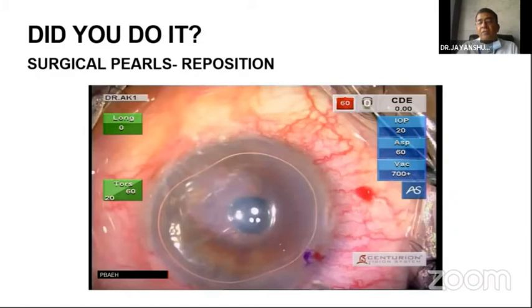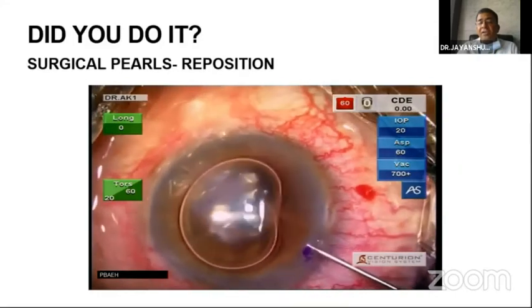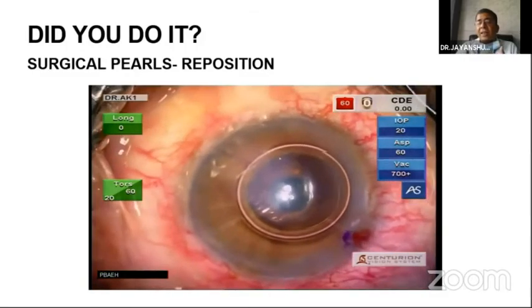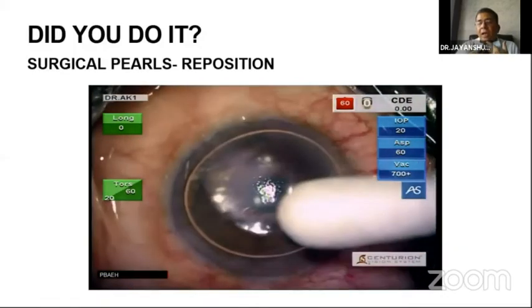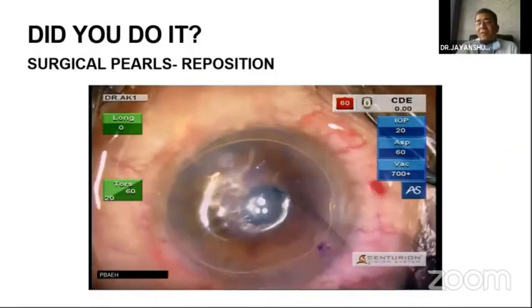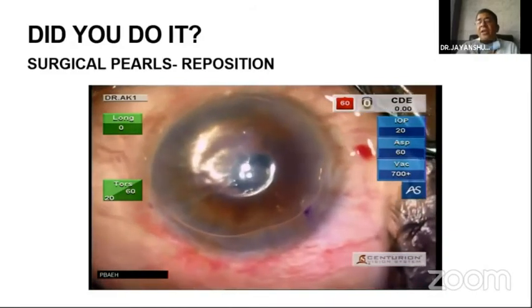So that is why the fluid, as I said, makes a plane between the detachment and the stroma, and it tries to redetach repeatedly. So in those situations, it is very important to have a C3F8 sort of material. In this situation, you inject the fluid so that you can unfurl, then you reduce the air bubble, then you replace it once more, and you use the air bubble to unfurl the same way as we do in DSEK or DMEK, and then we tighten the chamber to the optimum pressure so that it remains attached.